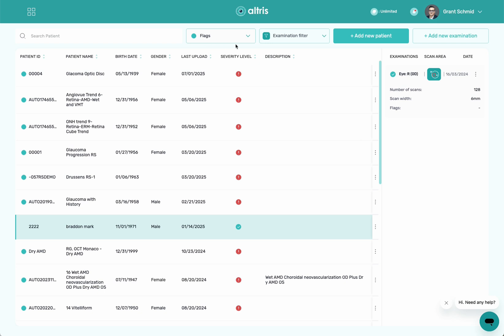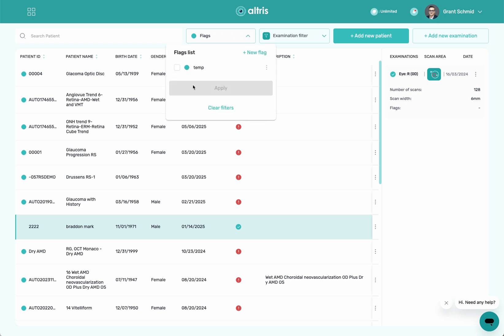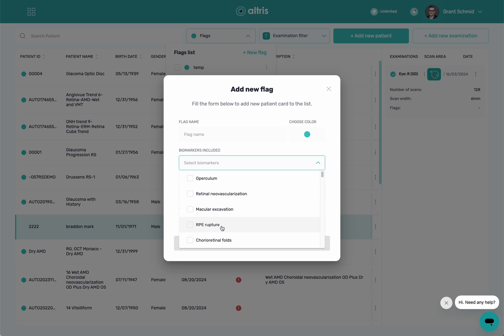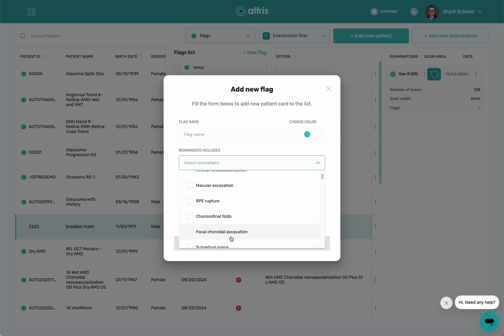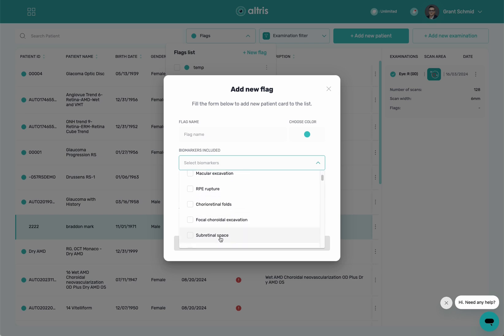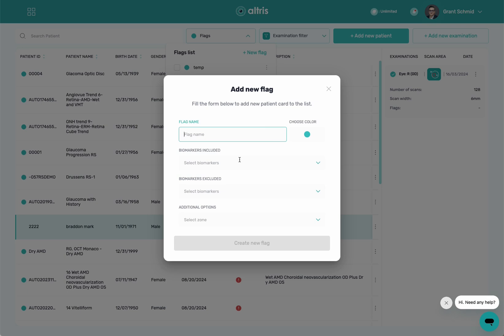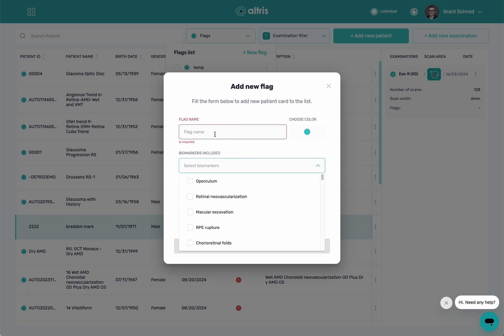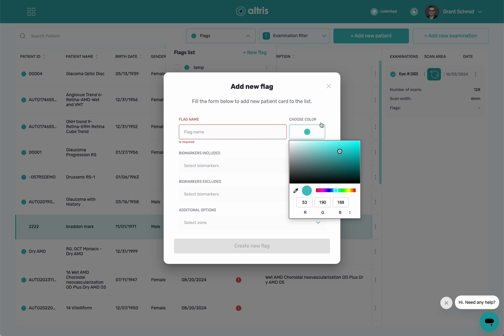Up here is our flagging system. Within the flagging system, what this allows me to do is create flags. Flags will identify patients that have certain features. So if I create a new one here, I can flag patients that have an RPE rupture, I could flag them with a subretinal space, and from there I could exclude different biomarkers or additional options. Then I can name that flag and choose a color.